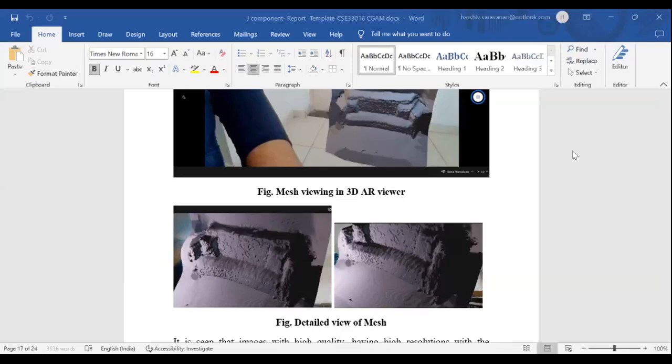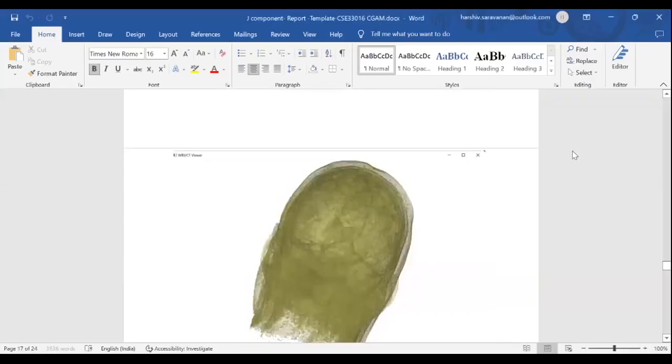Integrating the mapper for 3D to AR is a challenge. Many issues were faced regarding conflicting file formats during our implementation from 3D to AR. The task to convert our mesh to FBX format is not automated. The file supported for developing AR requires FBX format, and the models we have do not support storing the mesh as FBX. We stored it as OBJ and STL, which is exported as FBX via Blender for accomplishing the task correctly. So we need to find a way to automate the task.